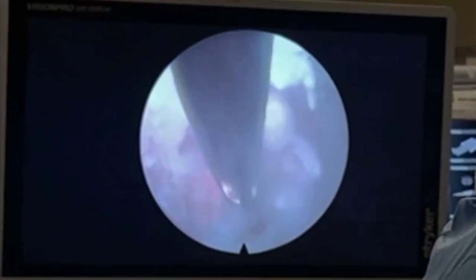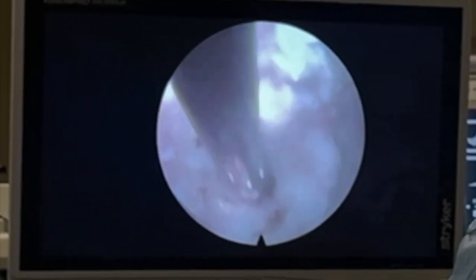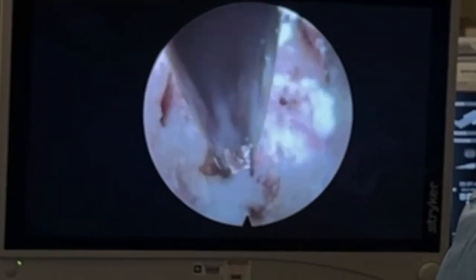Now I'm gonna use the laser to open this up a little bit better because the laser works way better on this hard, firm, rubbery tissue than all these other instruments. All right, I got my favorite instrument here, the side-firing YAG holmium laser. Look how well this works. It's non-electrical, so it won't electrocute the nerve either, so I can get right next to it.